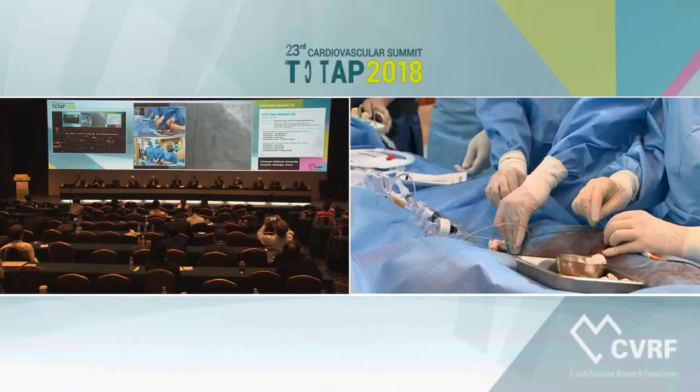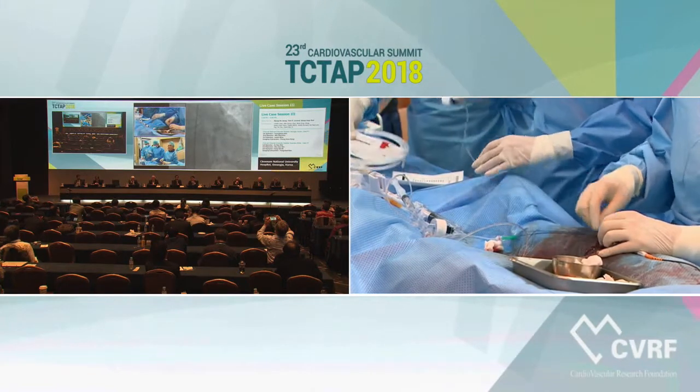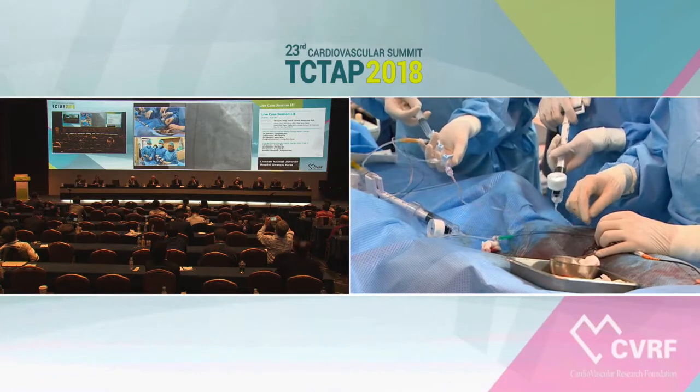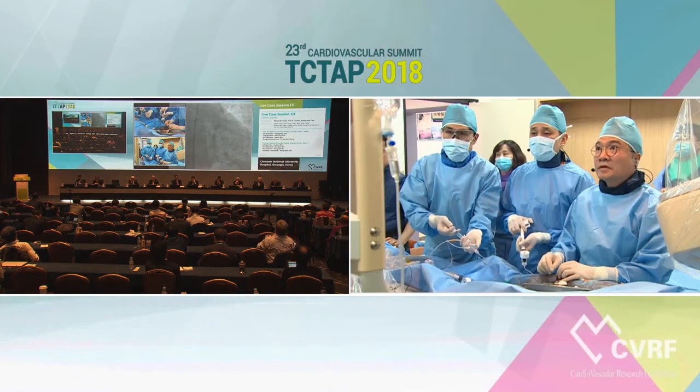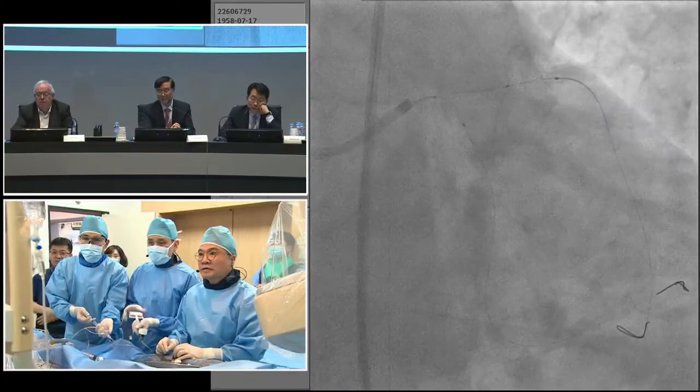Okay. Cool. All right, you want to do balloon dilation first, right? Yes, okay, yes.